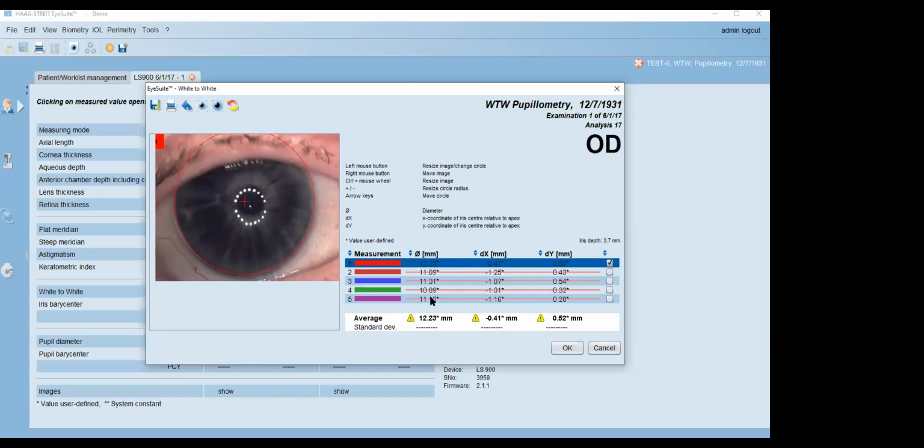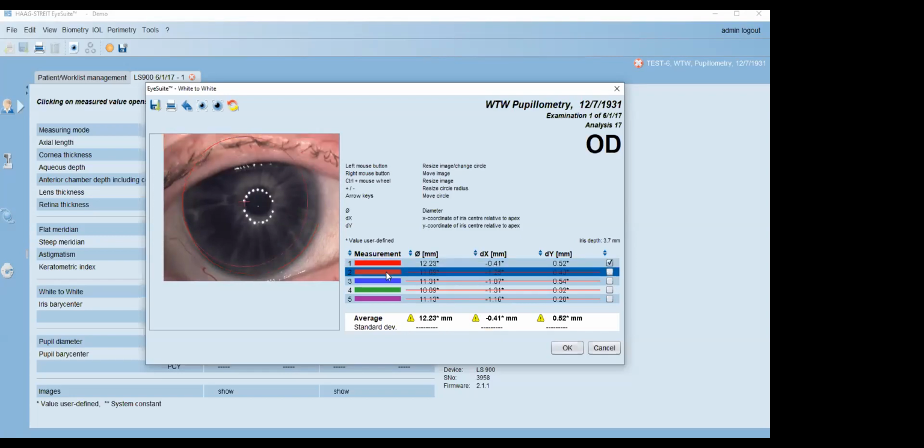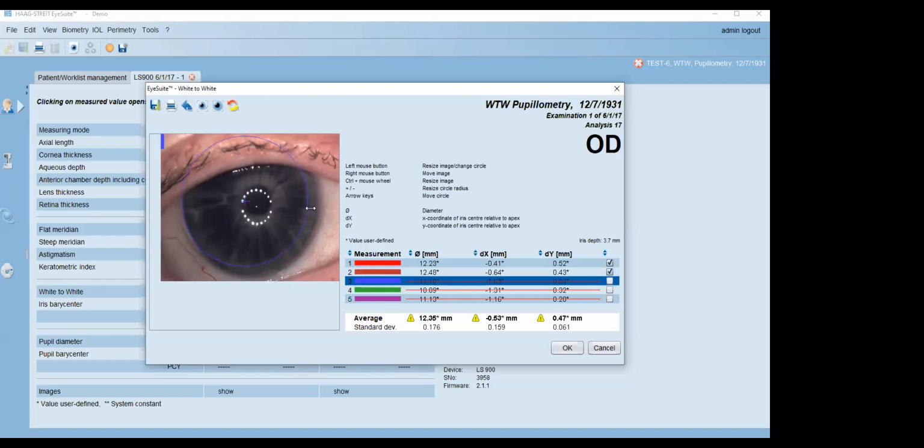However, if we eliminate all of the other measurements, we have a new caution indicating too few measurements result. So if you don't like seeing that caution, you do need to adjust 3 scans so that the software identifies an overall average based on 3 values.